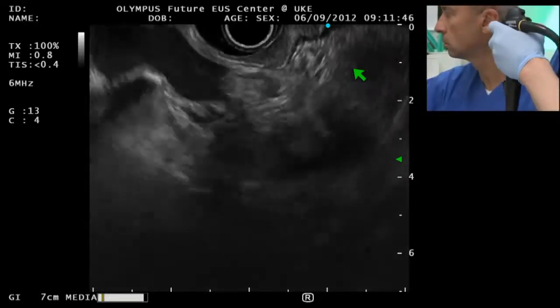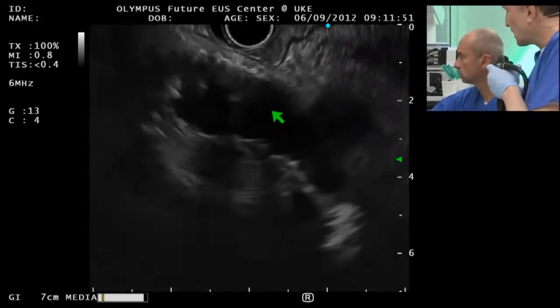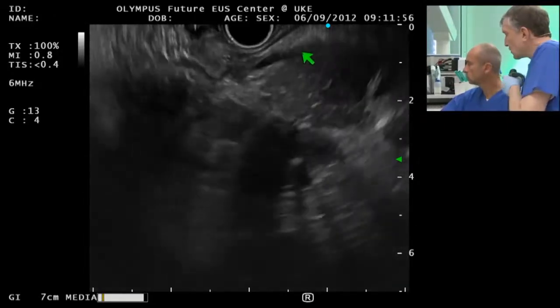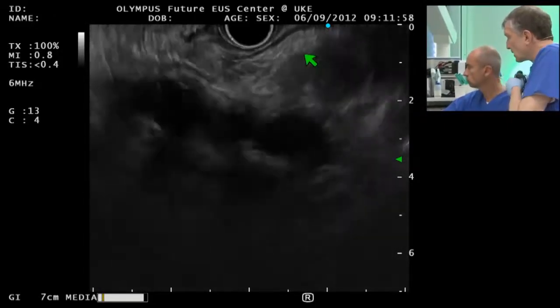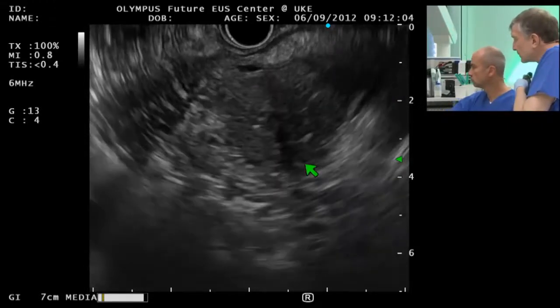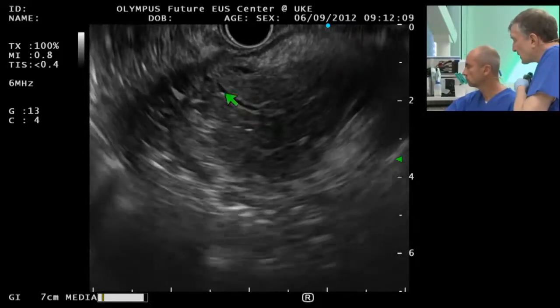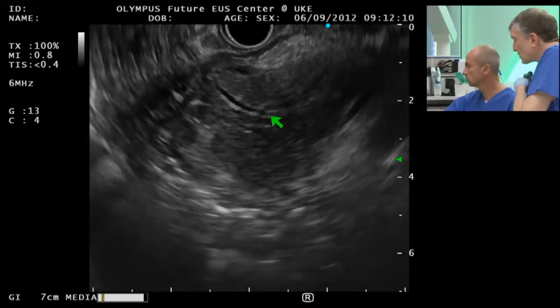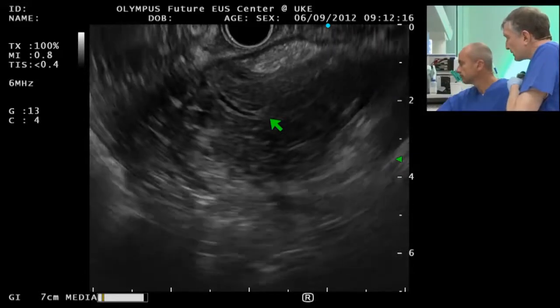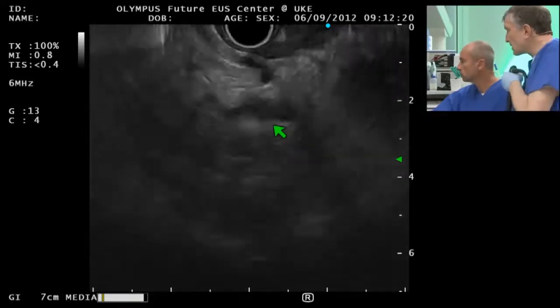Here's the aorta on the left side. And maybe that's the bile duct. But let's focus on the pancreas. So here we have the pancreas. There are some strands. Then here we have the duct, which has a normal caliber, but the wall is very thick. Would you agree or do you think it's normal, Bertrand? Yeah, a small thickening, a very quick thickening.